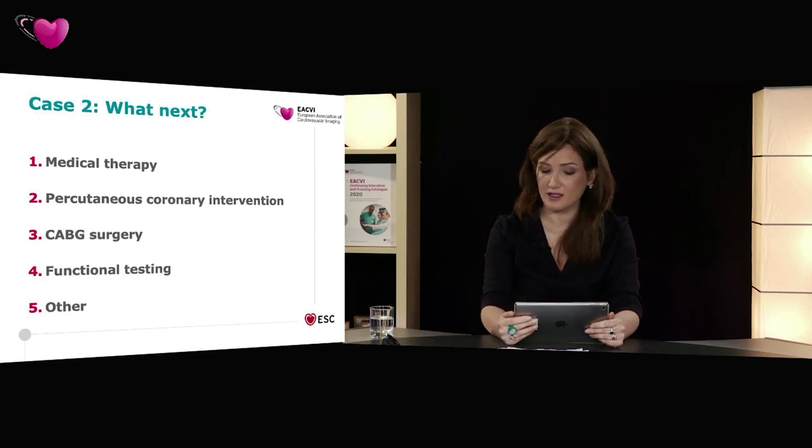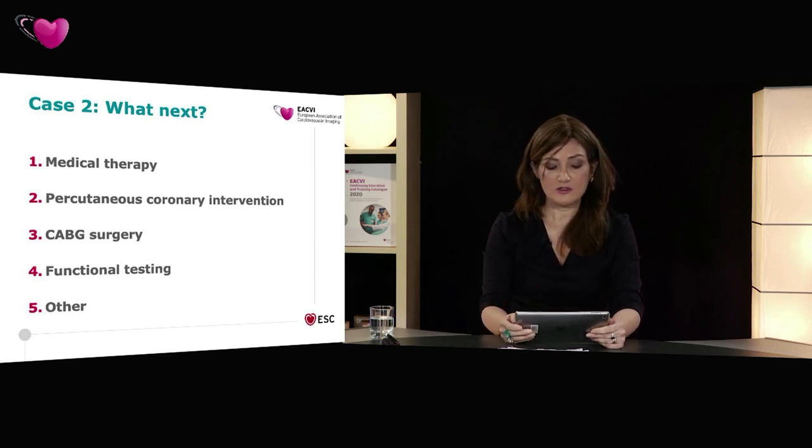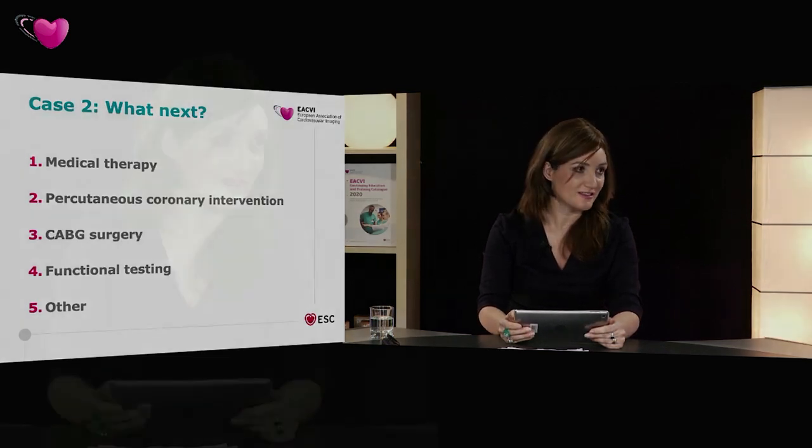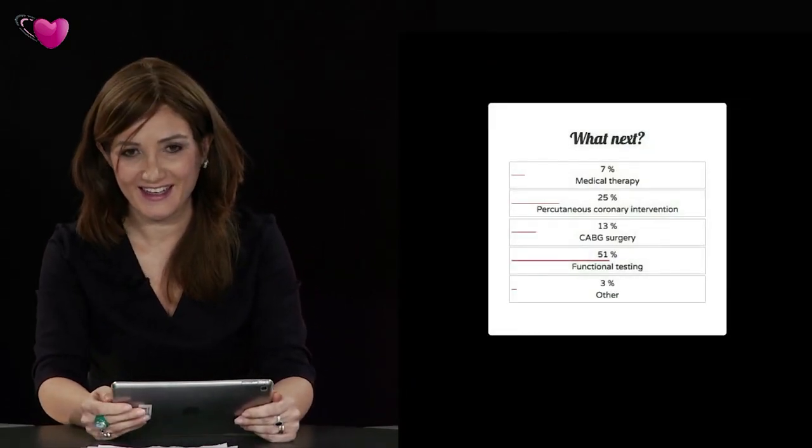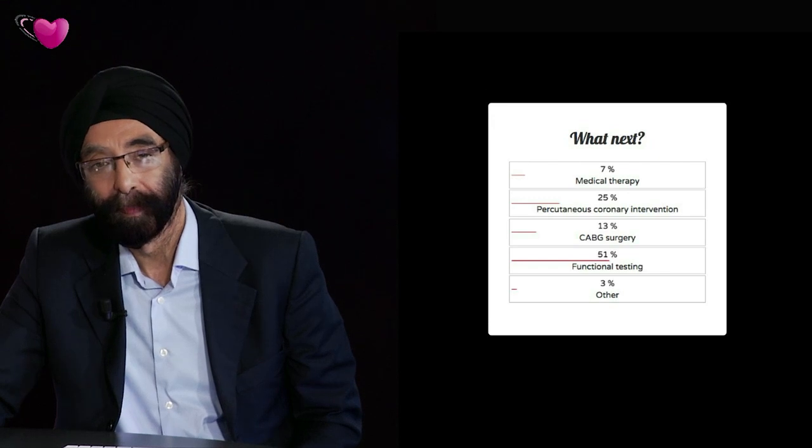What do you think, Nicole? So 51% will go for a functional test. This is what you need, I'm sure. A very good answer. So that's what we did. We proceeded to a stress echocardiogram.